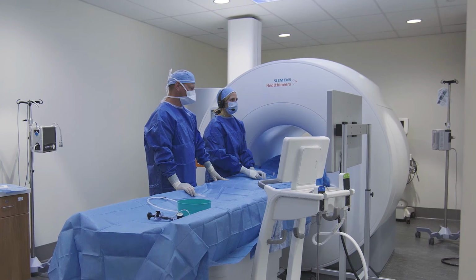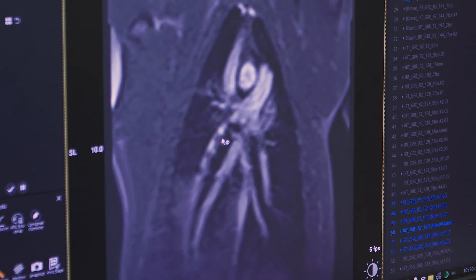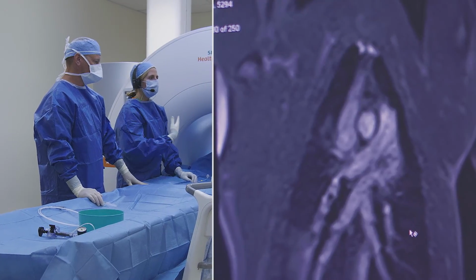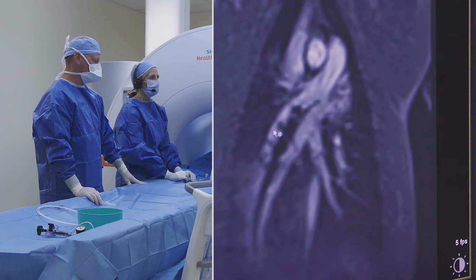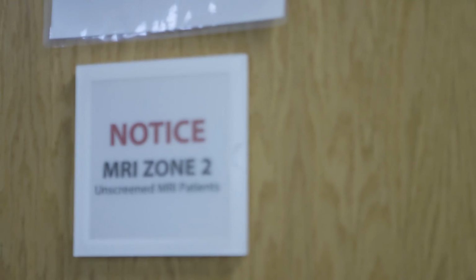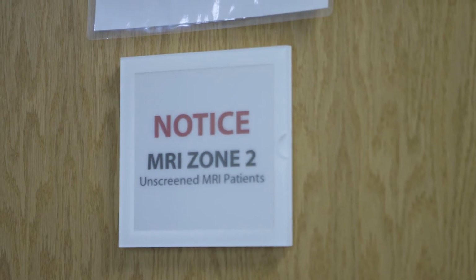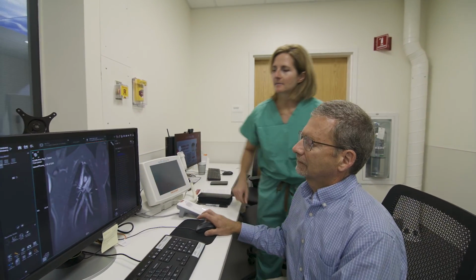This allows us to see all of the soft tissue, the vessels, the heart, whereas when we're using X-ray, we just sort of see this gray blob in the middle of the chest and we can't actually see where we're going. We do not know of any significant risks or dangers of using MRI. And I do think that ICMR will come to fruition and will really change the field and hopefully eliminate X-ray from cardiac catheterization.